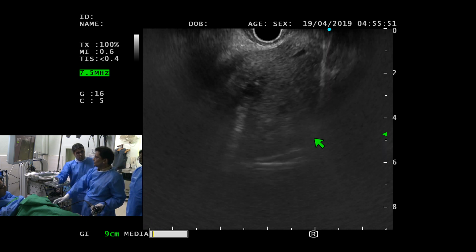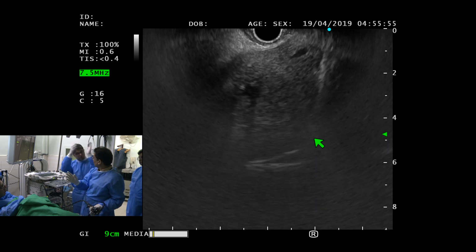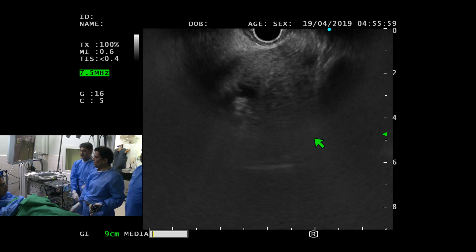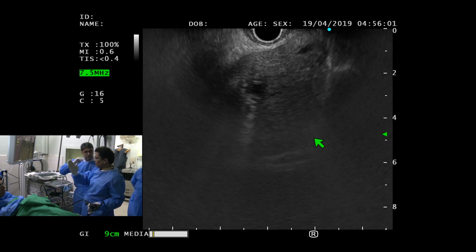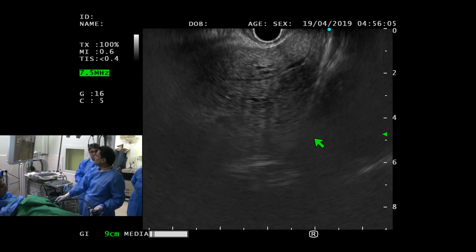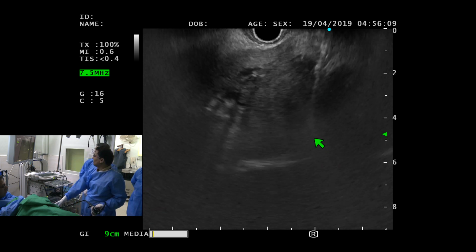In the EUS scope, what allows us to look from the anterior of the patient to the posterior is your left hand going to clockwise torque, right? Okay. So it's a 90 degree or what? So, okay, when you've seen the liver, the first maneuver which should start to happen is that your left hand starts the clockwise torque.